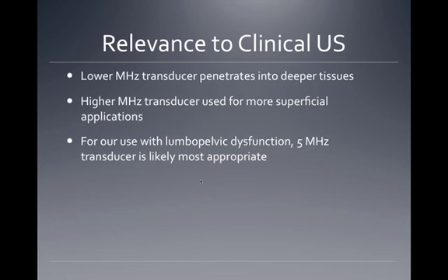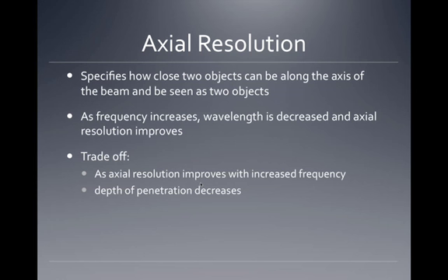And really, for what we're looking at, we can get away with either of our sound heads, but the 5 megahertz does seem to work, I guess across the spread, a little better. You can use it for deep multifidi. It gets through a lot of soft tissue, gets you fairly good resolution. If you were trying to look at a rotator cuff, you're going to want to have the higher resolution sound head in play. We have both of them for us here.